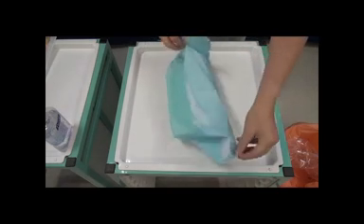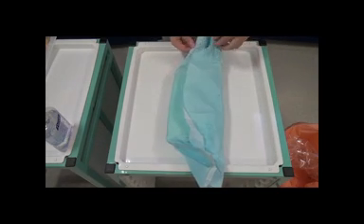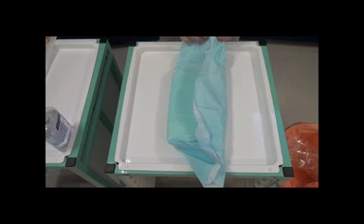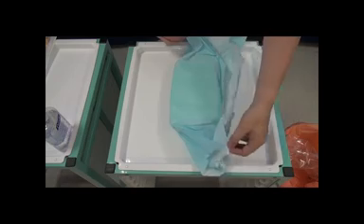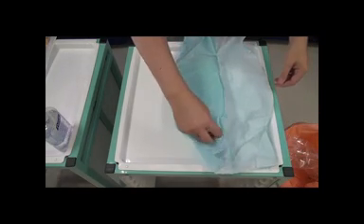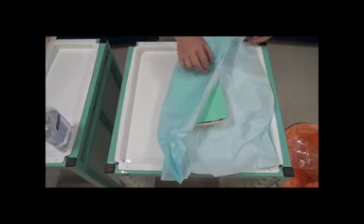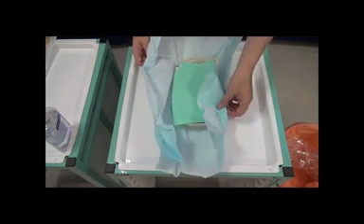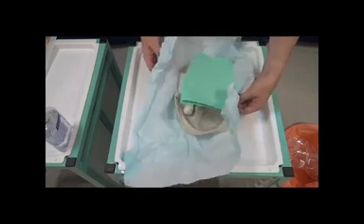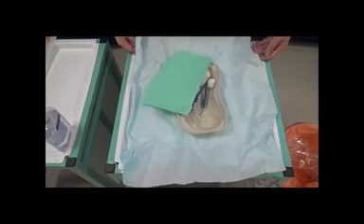Make sure you only touch the underside and not the top of the sterile field itself. Once you've created your sterile field, nothing that isn't sterile should ever touch this sterile field. If it does, you will have to start again. You can then use the underside of the sterile field to move some of the equipment around a little bit to gain access to your tray.